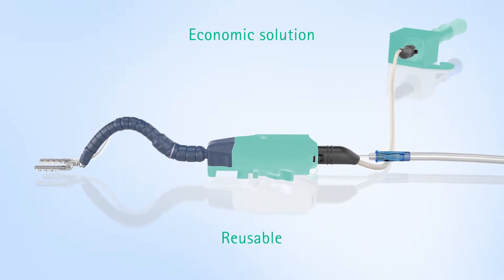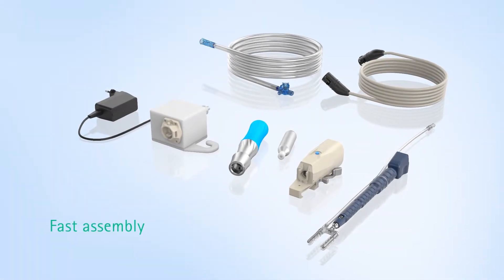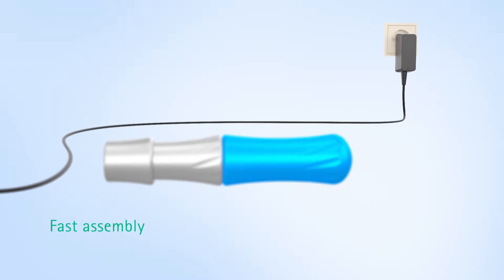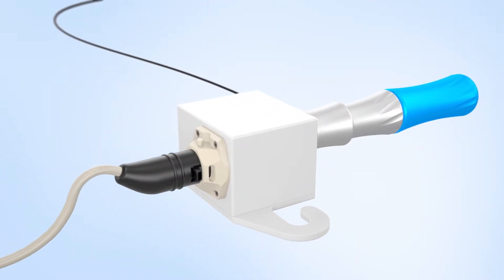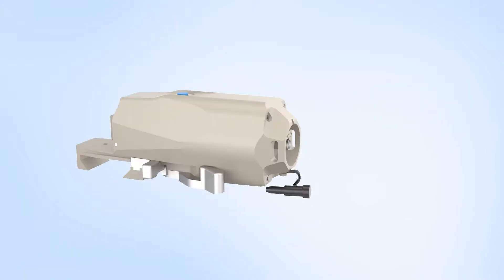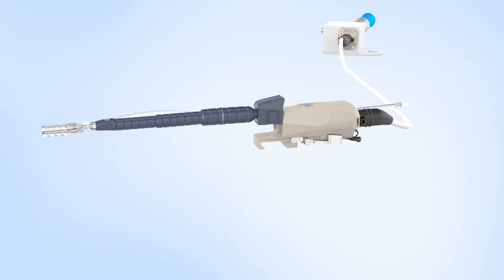All parts can be assembled quickly and easily. First, connect to a power source, then insert the CO2 cartridge adapter into the FlexHeart adapter and connect the cable for the air and power supply. The cable and device are then connected to the FlexHeart clamp.